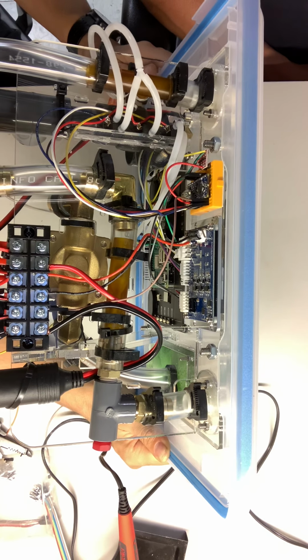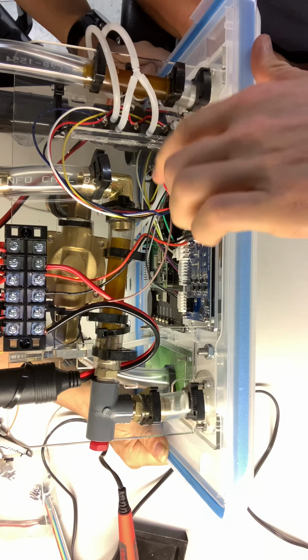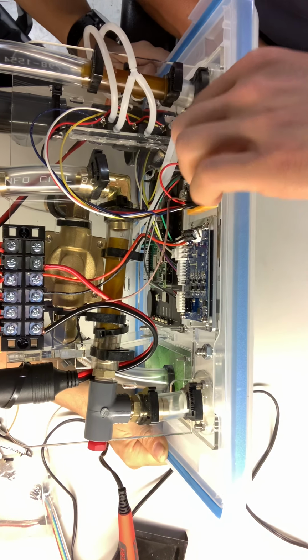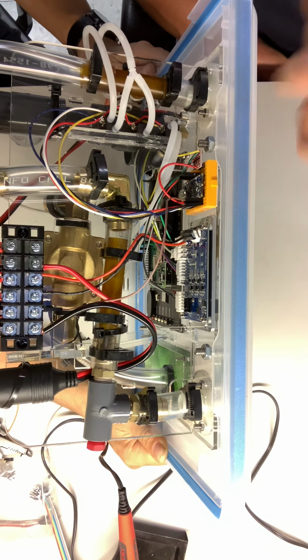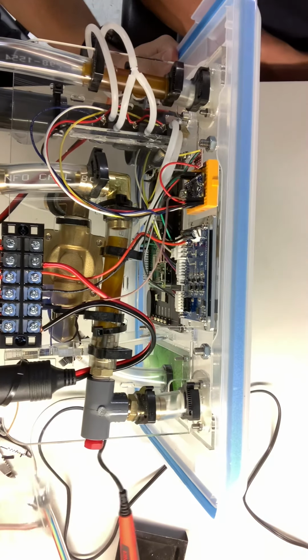Moving to the right, we have the power that's going to our level shifter, just jumping across that board to this level shifter here. Yep. Also from the pointer. Yeah, let me get a pointer.